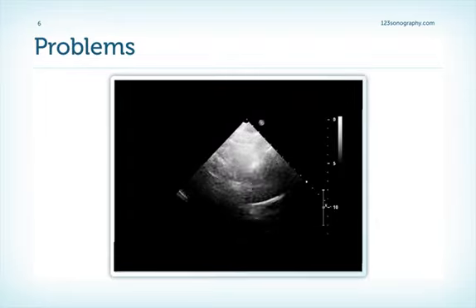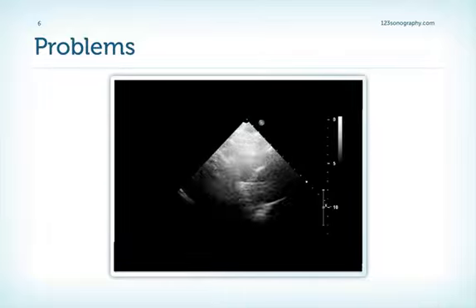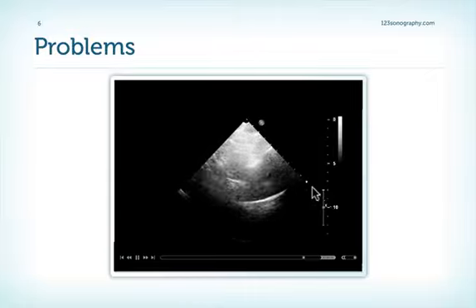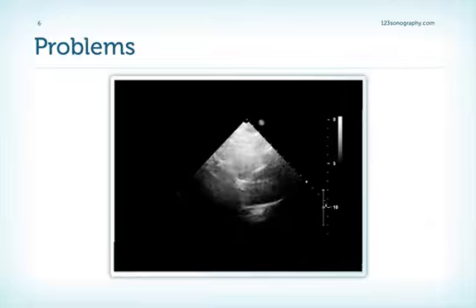I would like to tell you a story. Many years ago, I was called to a patient who had acute chest pain, and the question was what the cause of chest pain was. Now, he didn't have any ECG changes and he had no regional wall motion abnormalities, but what I found was linear structures in the ascending aorta. This is not the same patient, but a patient who has just the same finding. Now, the patient I investigated had a known dissection in the abdominal aorta, so I was kind of convinced that dissection was also present in the ascending aorta, which is an indication for operation, and that's where I actually sent him. Well, fortunately, we also performed a TEE study, and there was no dissection.